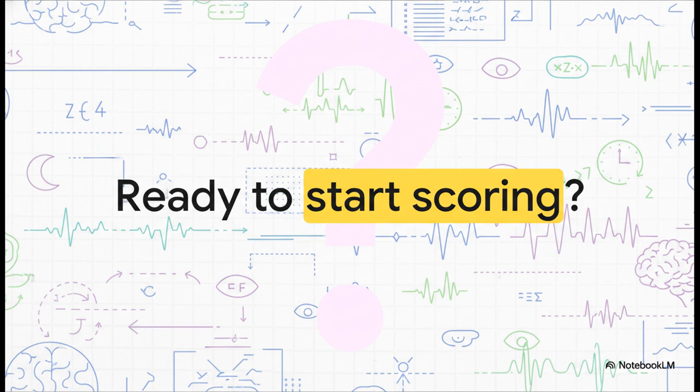So there you have it. We've gone all the way from the basic setup to learning the alphabet of brainwaves to understanding the rules for each stage, and even some of the more nuanced logic behind it all. We've built the entire foundation. So the only real question left is, are you ready to start scoring? Because now you've got the tools to begin.